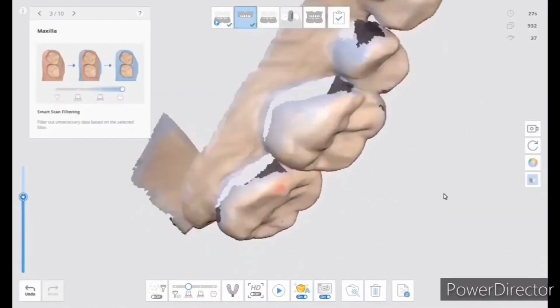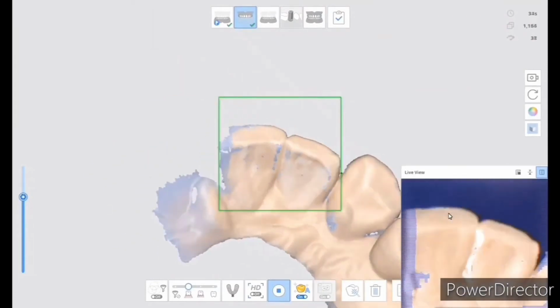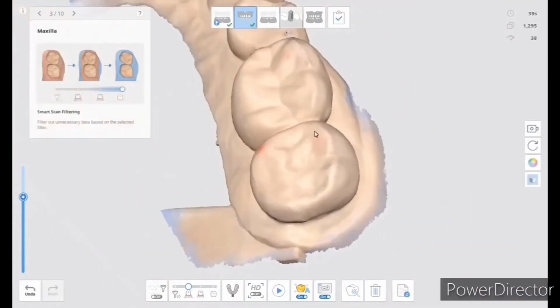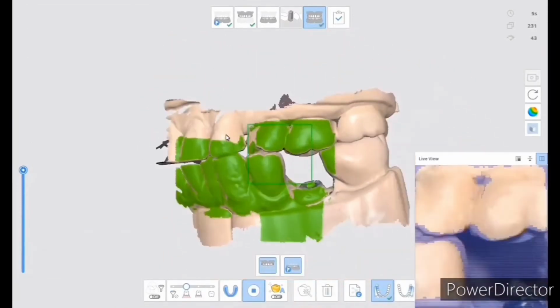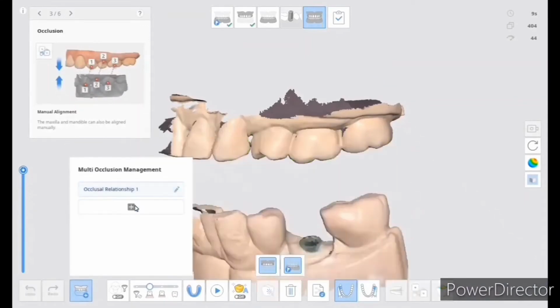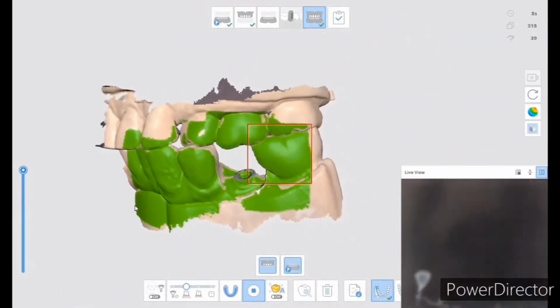Generally, one projector and two cameras are used for mouth scan using structured light three-dimensional imaging. The projector can cast different stripes according to needs, and the camera collects stripes. Finally, the 3D data of the scanned object is restored by algorithm. The principle of 3D structured light intraoral scanning is very simple, and the engineering implementation is not difficult.